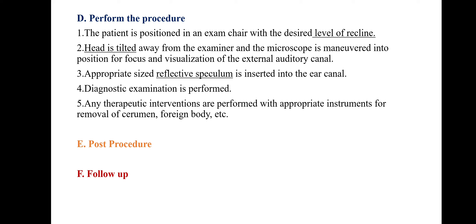Performing the procedure: The patient is positioned in the exam chair with the desired level of recline. The head is tilted away from the examiner, and the microscope is maneuvered into position for focus and visualization of the external auditory canal. An appropriate size reflective speculum is inserted into the ear canal. Diagnostic examination is performed, and any therapeutic interventions are performed with appropriate instruments for removal of cerumen, foreign body, etc.